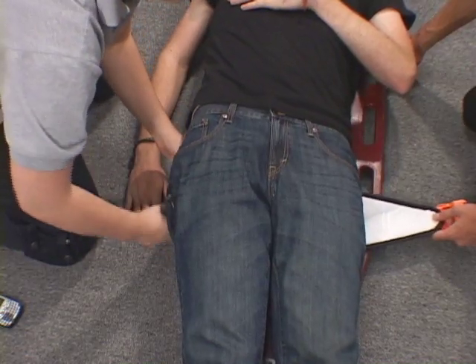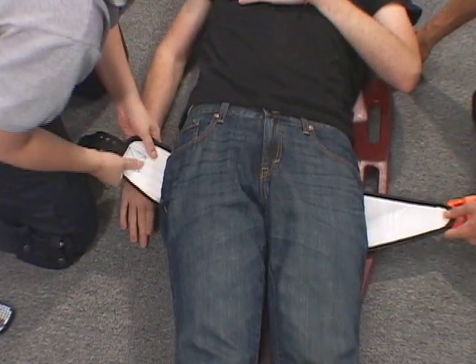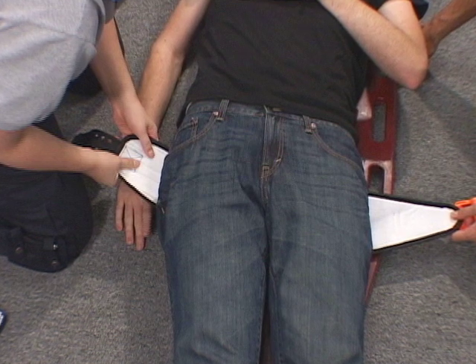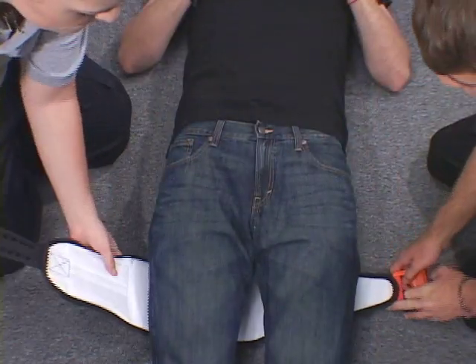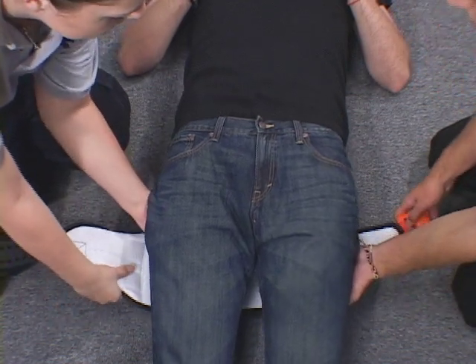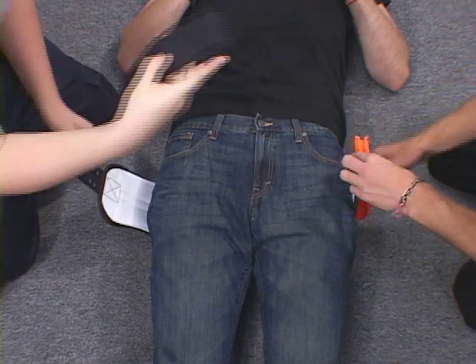Then reach beneath the patient and pull out the end of the accordion flap. At this point, the sling should be positioned beneath the patient at the level of the greater trochanters. If necessary, slightly lift the patient to position the sling at the trochanteric level and shift the buckle just off-center.